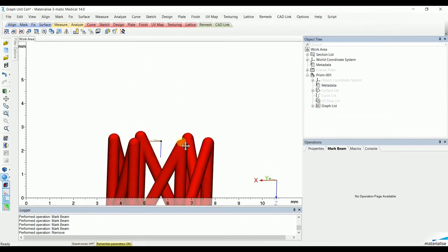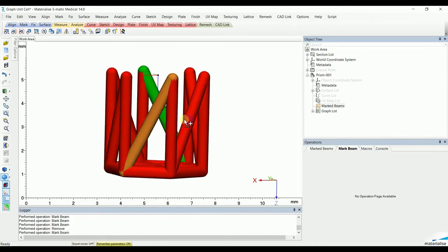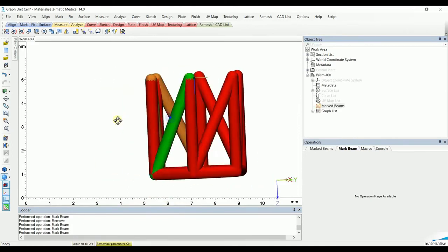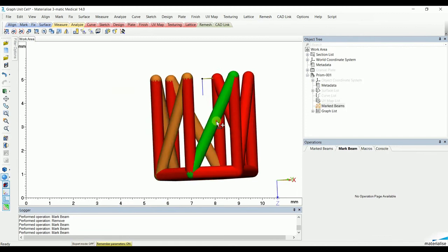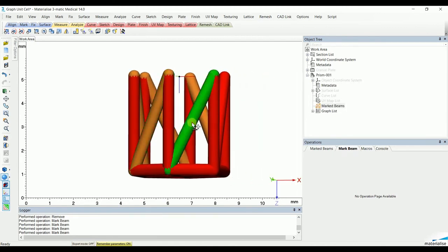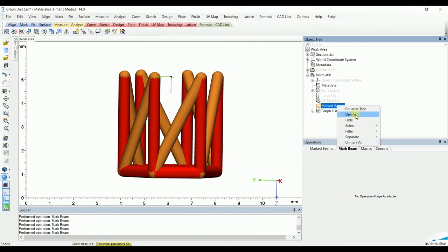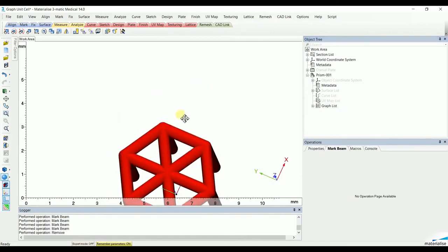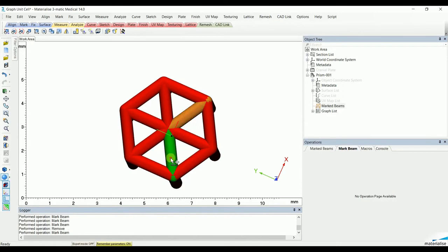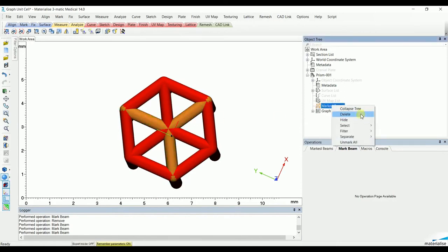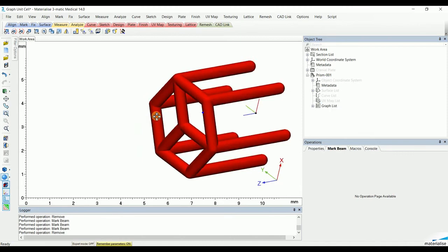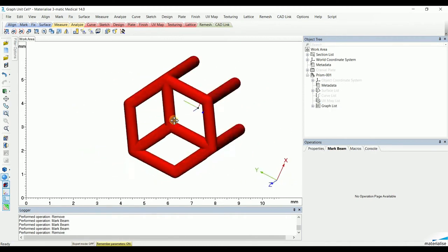You can do the same for the sidebars and once again hit delete. Now, because we would like a honeycomb structure, we will also remove these last three beams from our base. This leaves us with a nice graph unit cell that can be used in lattice structures.